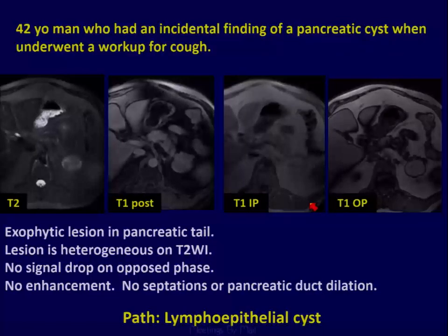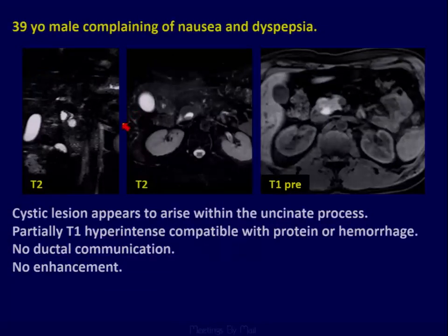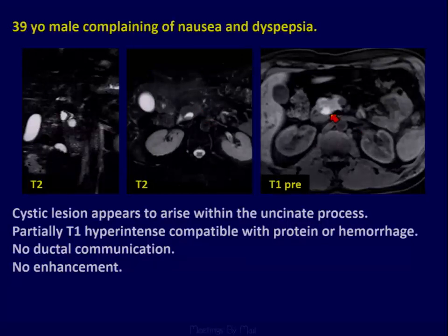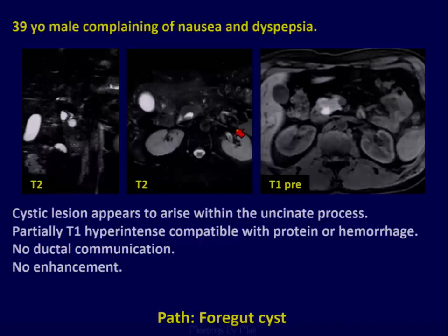It can be very challenging when you're dealing with pancreatic or peripancreatic lesions. Here's another example: a patient with nausea and dyspepsia — symptomatic. This is a T2 bright lesion, also T1 bright, suggesting maybe hemorrhage or protein with some layering. No ductal communication, no internal enhancement, no mural nodules, no dilated pancreatic duct. This was pathologically a foregut cyst.